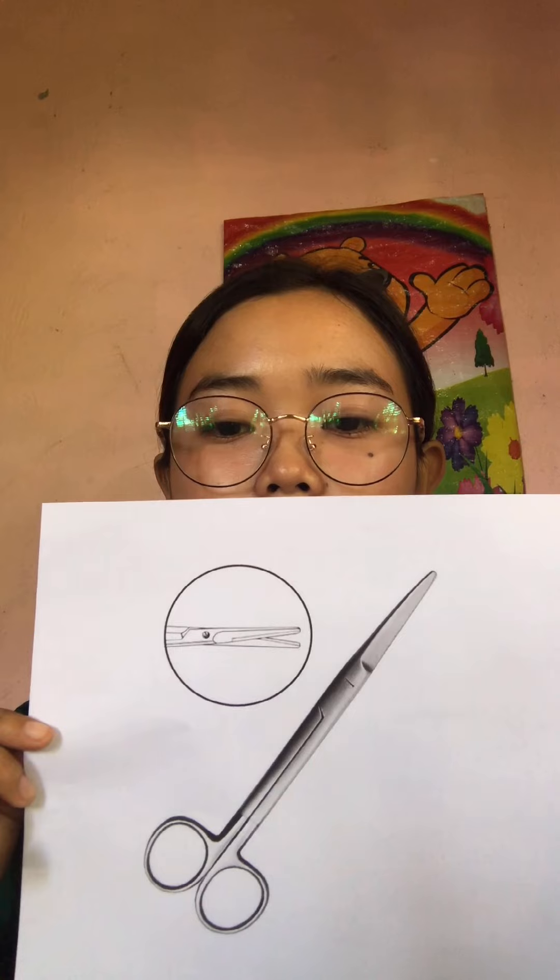Next I have here the cutting and dissecting instruments. These are sharp instruments used to cut body tissues and other surgical supplies. I have here the straight Mayo scissors, used to cut sutures and other supplies. We have the curved Mayo scissors, used to cut muscles like the uterus, breast, and ovaries. Next would be the Metzenbaum, used to cut delicate tissue. I also have here the Electrocautery, used to cut very tiny vessels.